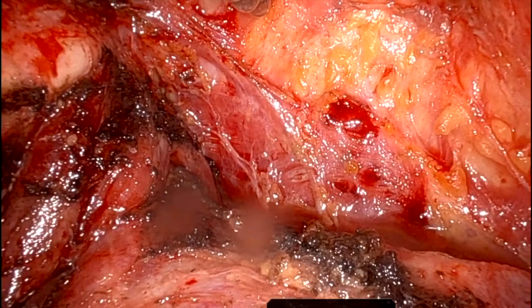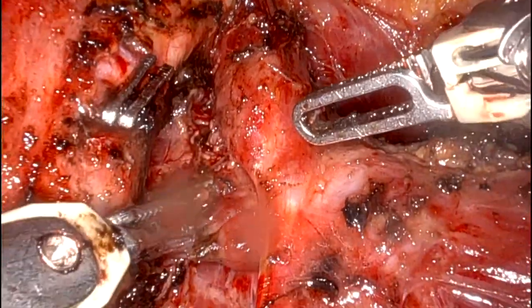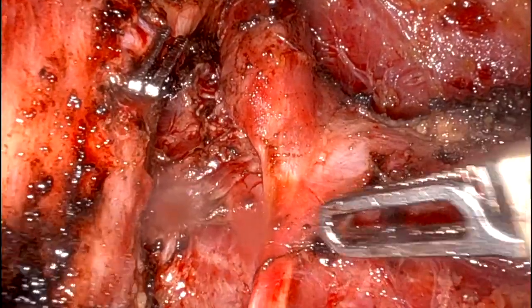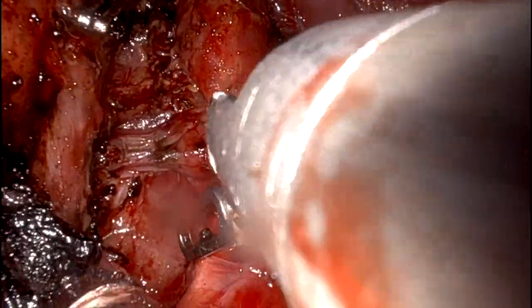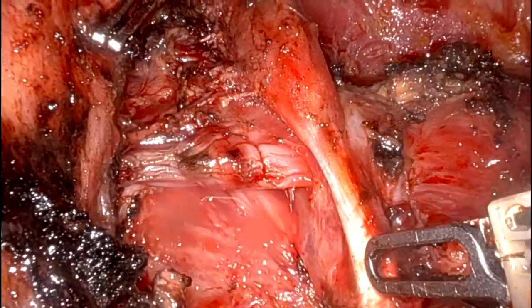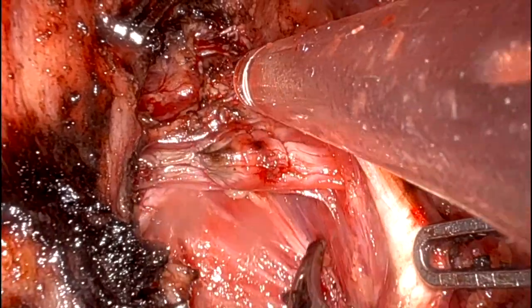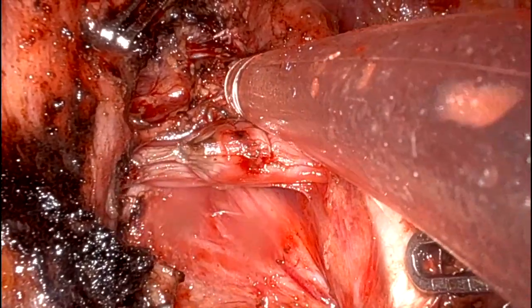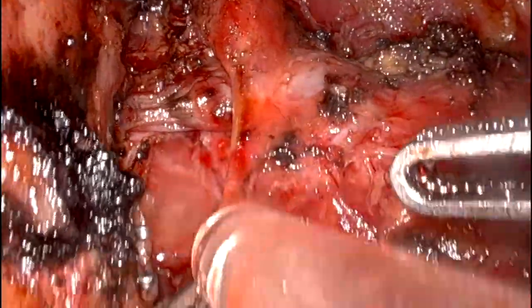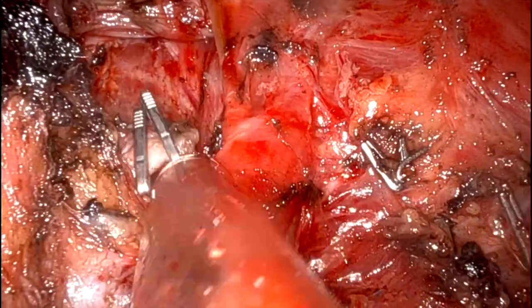You can see the platysma. You can see the bellies of the digastric, ipsilateral and contralateral. Now we are at level 1B. This is the mylohyoid muscle. Coming back, this is the facial artery and this is the hypoglossal nerve. This is the hypoglossal emerging from the digastric.